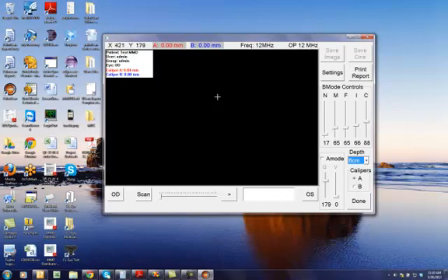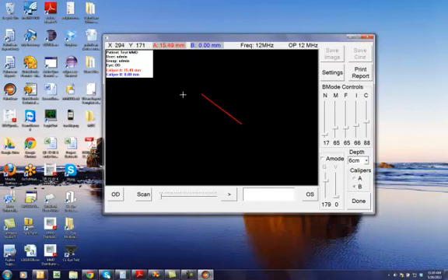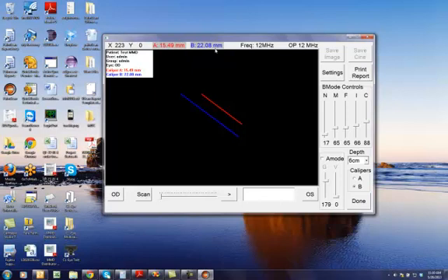The calipers are used to taking measurements. There are two calipers, caliper A, which is in red, and caliper B, which is in blue. They give you the measurements that you can make on the image.